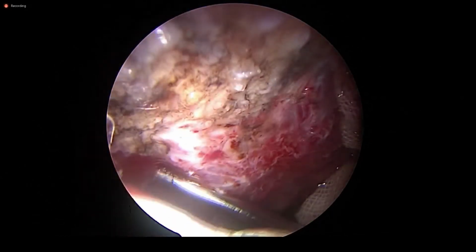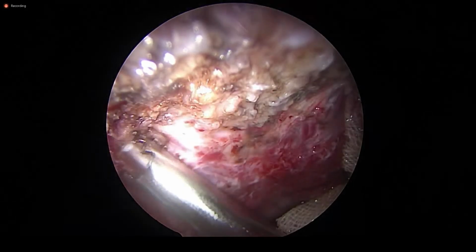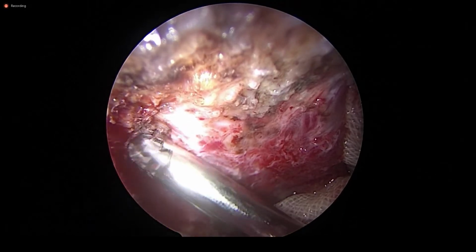See, push your blade, keep the cutting edges in view and allow the adenoid to fall. Only the soft adenoid tissue will come and jump into the blade, not anything else. Musculature will never jump into it.